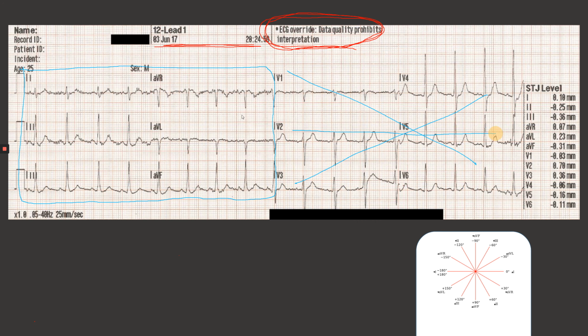I'm only looking at these because these limb leads right here, they essentially go around the side of the heart, right? If I'm looking at what these leads look at, first of all the leads are pretty much looking at the left ventricle for the most part, except for V1 through V4, kind of the front of it.